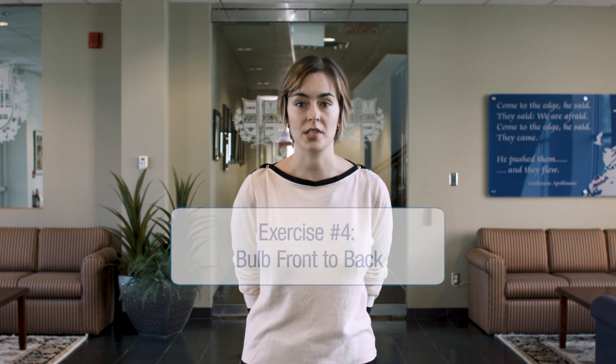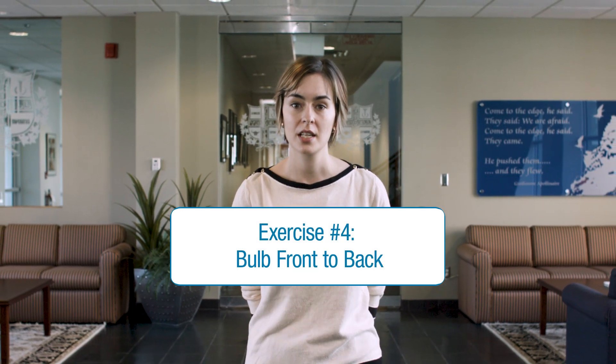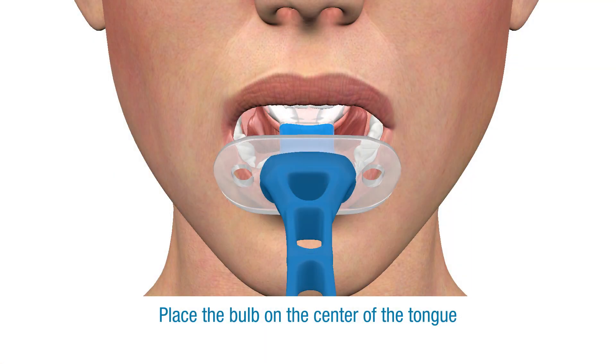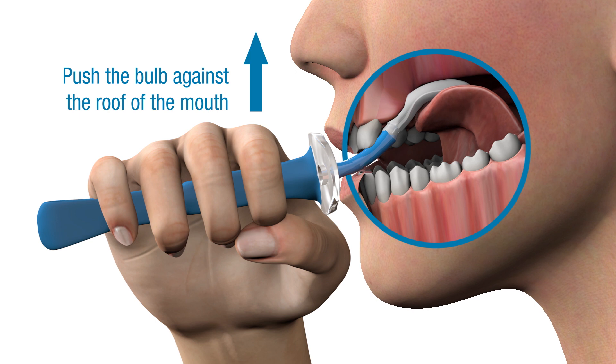The bulb front-to-back exercise is designed to support coordination and control of your tongue to aid you in forming a ball of food and moving it to the back of your mouth for swallowing. Place the bulb of the Ablex device on the center of your tongue. Then, using only your tongue, push the bulb against the roof of your mouth, creating a slight suction.